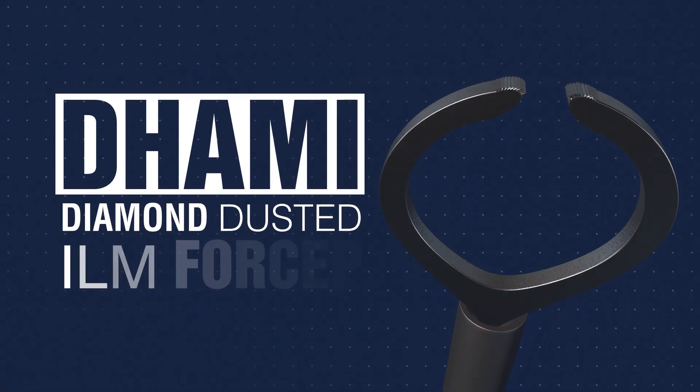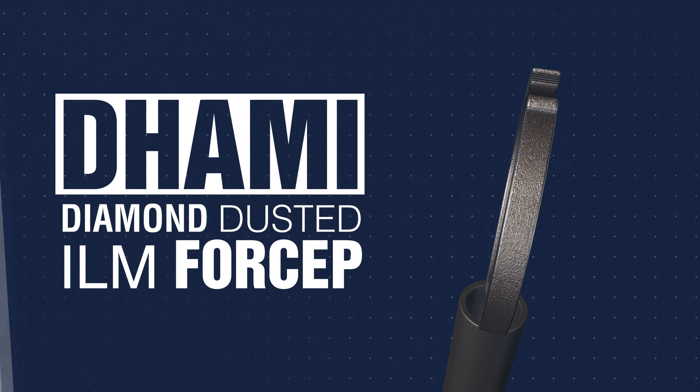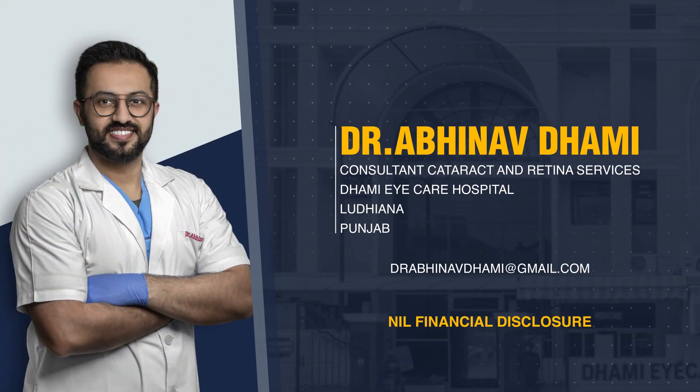We present our initial experience with the Dhamis Diamond Dusted Internal Limiting Membrane Peeling Forcep. The authors and makers have no financial disclosure.